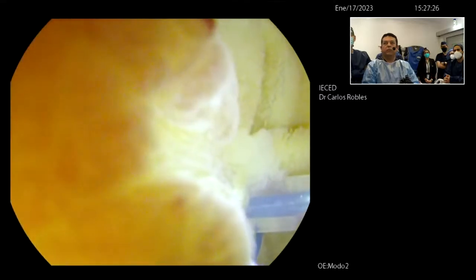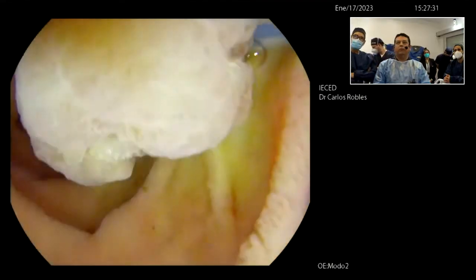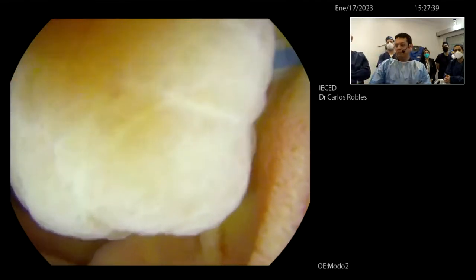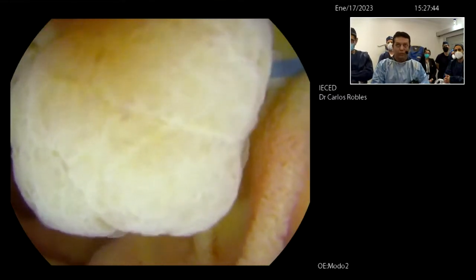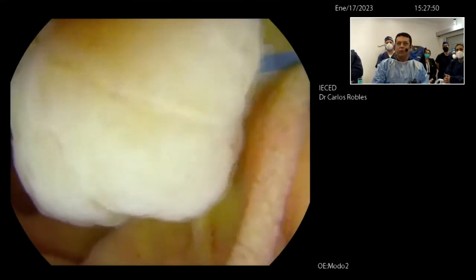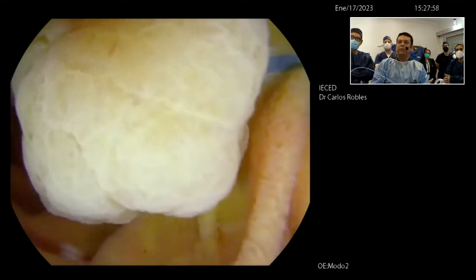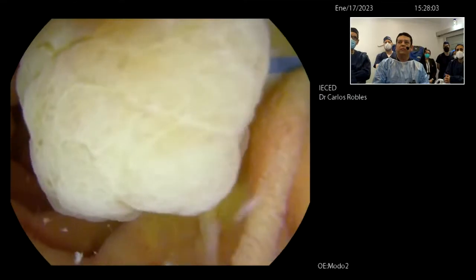Just with forced coagulation. No bleeding. It means I do a very good job. What do you think? No bleeding, huh? And a big vessel. That's very good. So the strategy was good, and this is what we need to do. It's not just to cut. We need to think in the right strategy to do a resection. So this is a very nice resection, very safe for the patient and very safe for us also. So everybody is winning in this resection now.